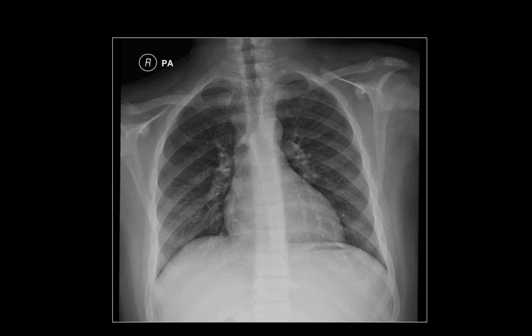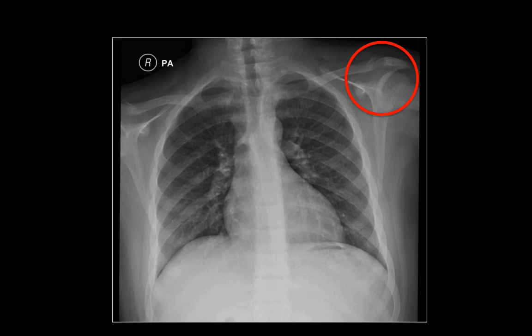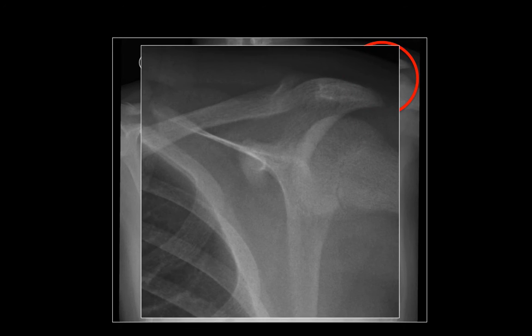Findings. The x-ray may appear normal at first glance. However, it's very important to have a systematic approach and to look at the periphery of the film. Inspecting the peripheral osseous structures reveals that the acromioclavicular joint has an abnormal appearance. Now let's enlarge this area and look carefully at the joint. The first thing you notice is that the distance between the acromion and clavicle is widened.